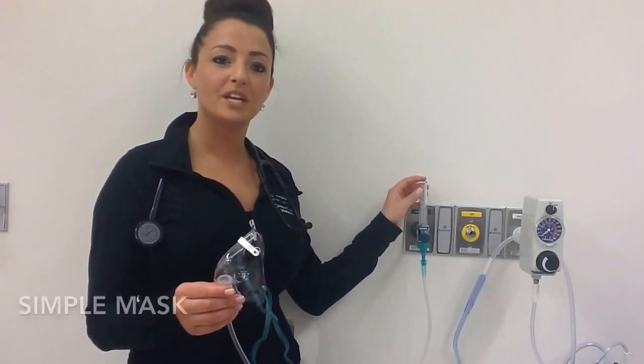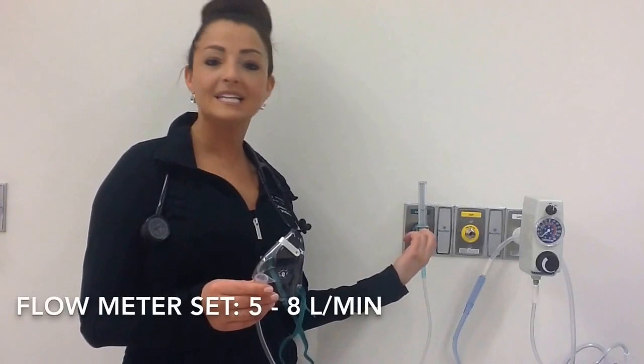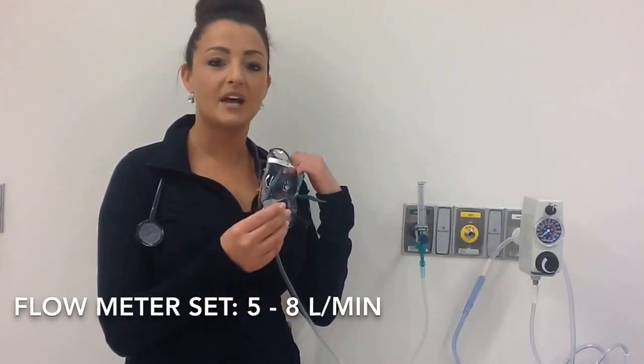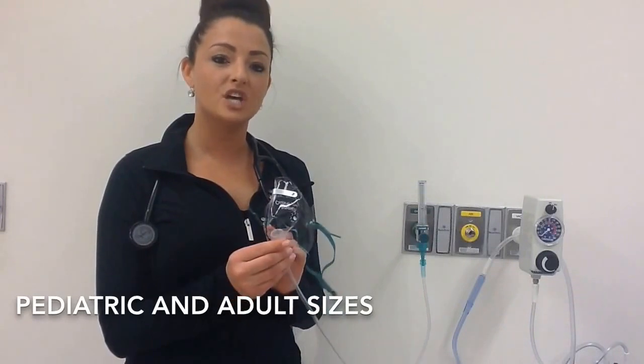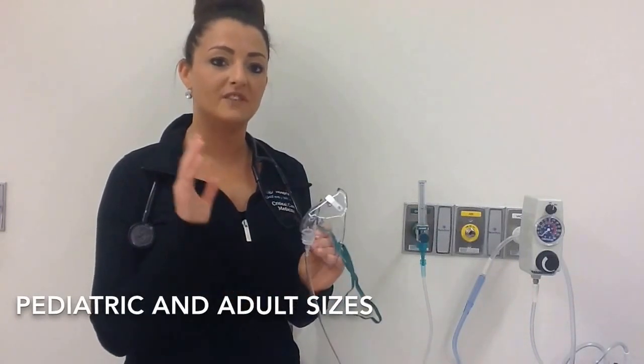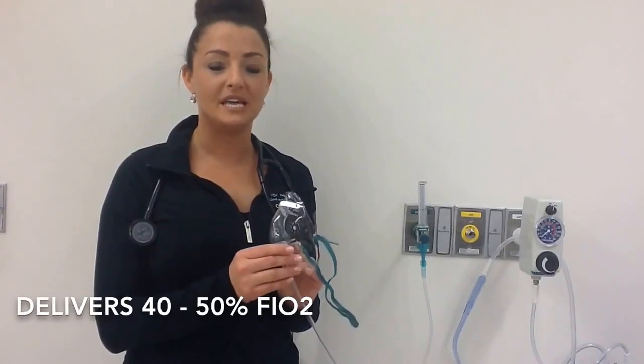Great. Hi, I'm Katie. The first thing I'm going to talk to you about is the Simple Mask. You attach it to an O2 flow meter with no humidification. The liter flow must be set at 5 to 8 liters to adequately wash out carbon dioxide under the mask. It comes in 2 sizes, the pediatric and the adult, which is chosen based on patient facial size. The FiO2 delivered is between 40 to 50%.